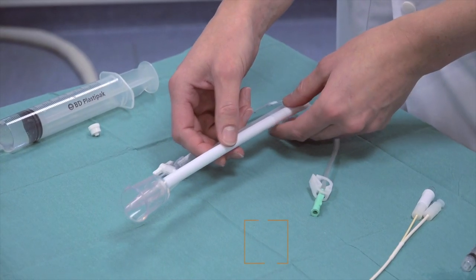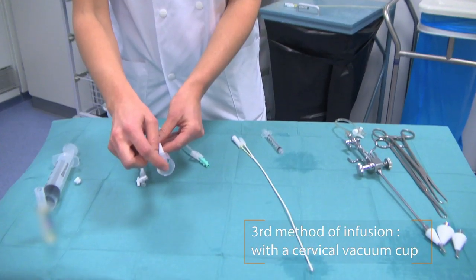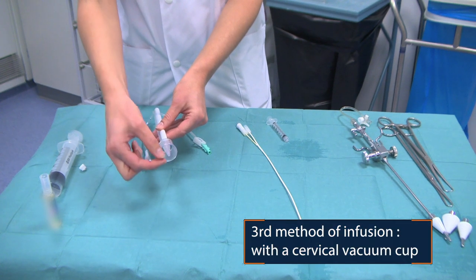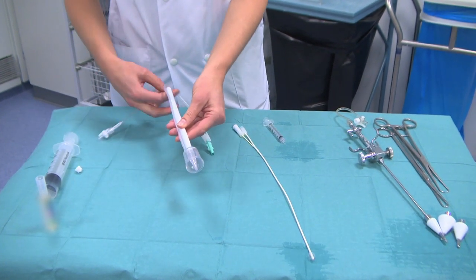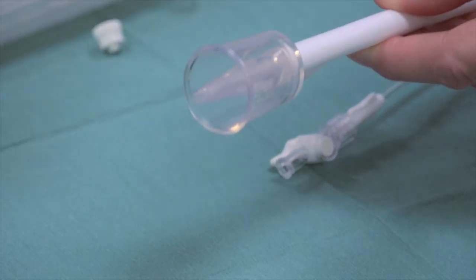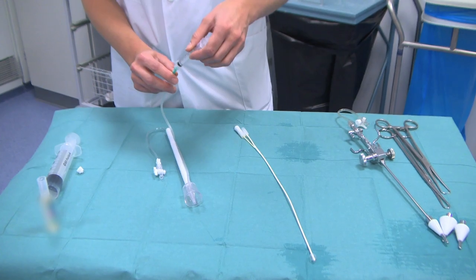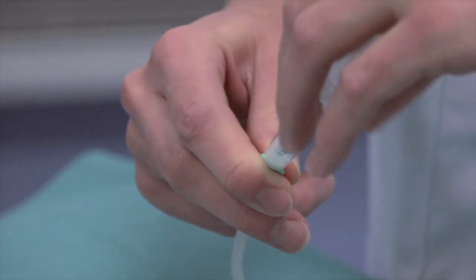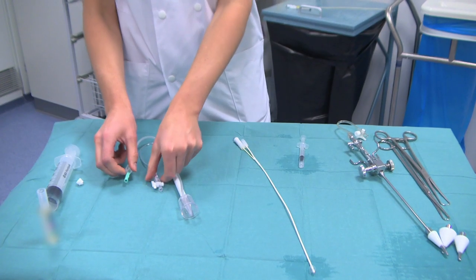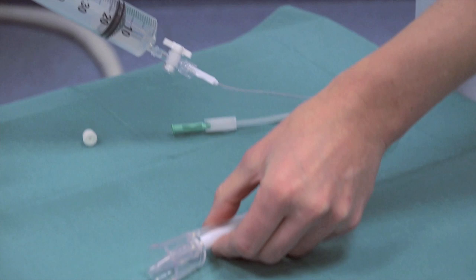The last way to insert the contrast media into the uterus is the cervical vacuum cup. This cervical vacuum cup you attach at the cervix with this part into the cervical channel. Then you put the vacuum through this one on the cervix so it will stay attached at the cervix. And then you can infuse the contrast media through this channel.